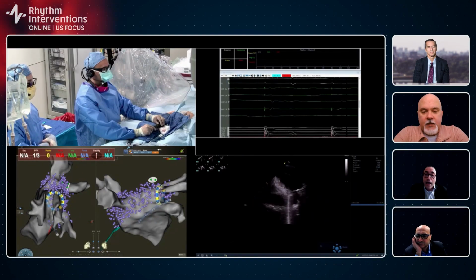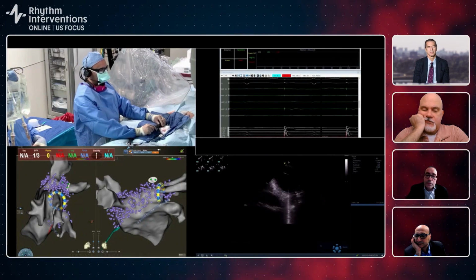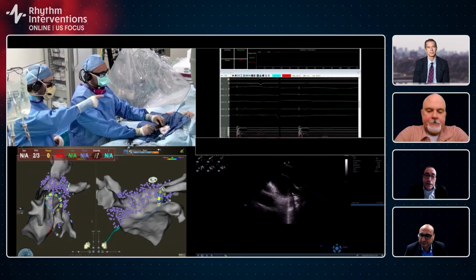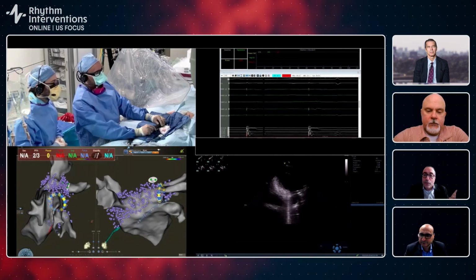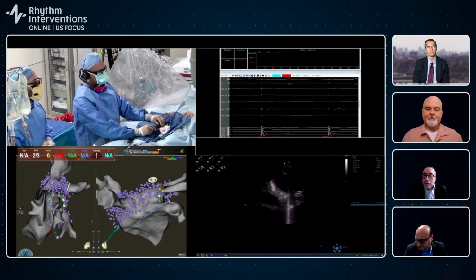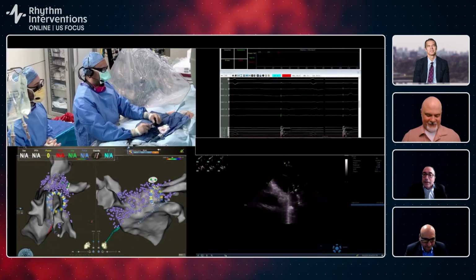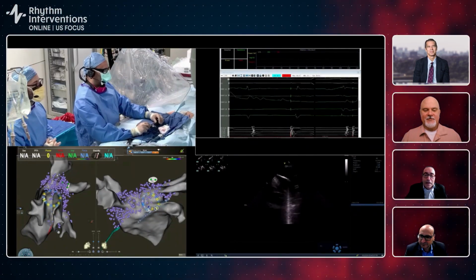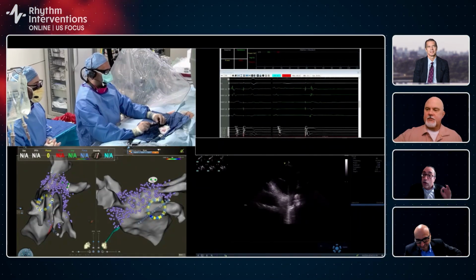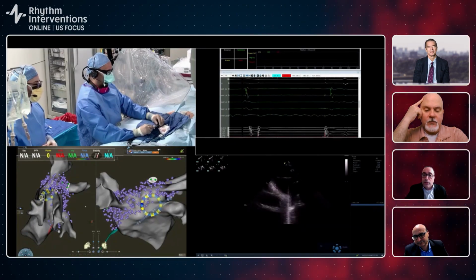I always get access, but I don't put the catheter in, meaning I keep the access ready. And it's ironic that I learned this from the master of electrophysiology, Dr. Chu, God bless him. I walked in one time and he didn't have a CS catheter. I was like, but Chu, you don't have a CS catheter. He's like, I don't need it in an AFib case. I was hesitant and skeptical, but then I adopted it and it's been great. But I always get access because I don't want to bother with the access later. If we need a CS, we just float it in.